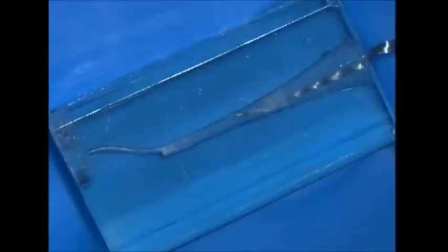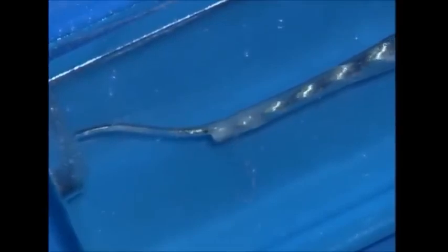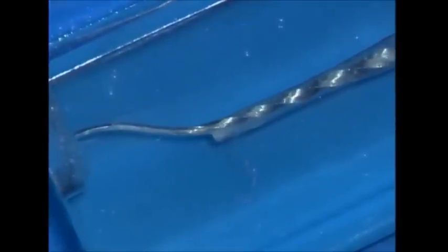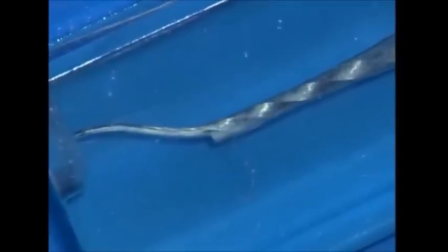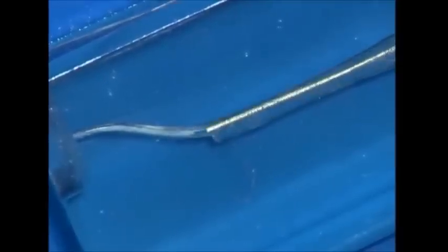Again, the pre-curved instrument is going to be reciprocated until its working end bypasses the ledge. Each one of these ProTaper instruments has multiple changing tapers over the length of their cutting blades, and these greater tapered instruments then can begin to refine and expand the glide path, and we can do some ledge reduction. Again, after its use, irrigate and recapitulate and re-irrigate.